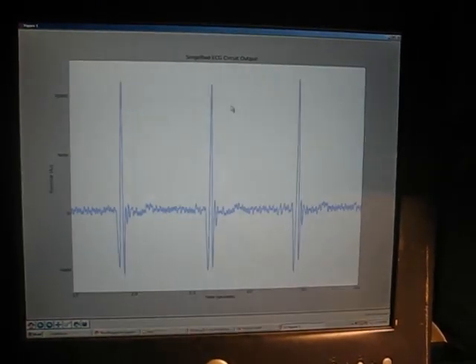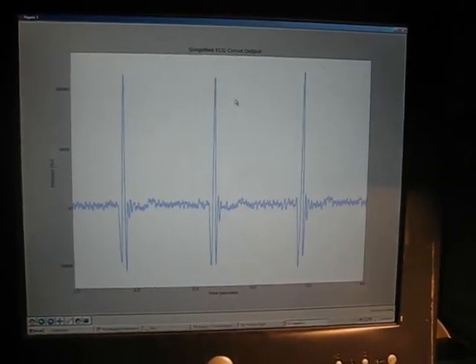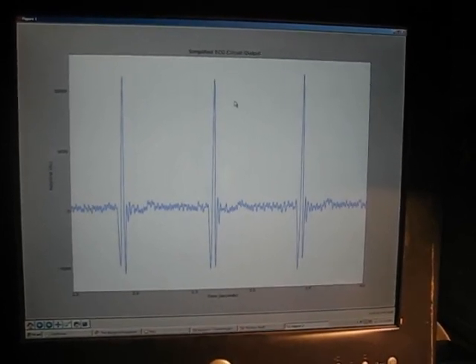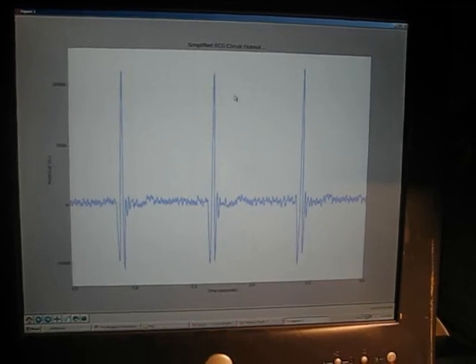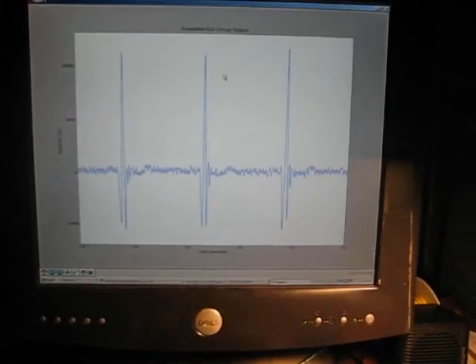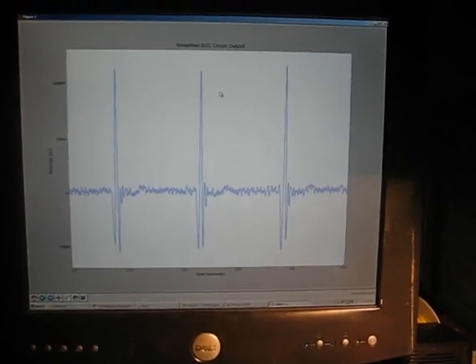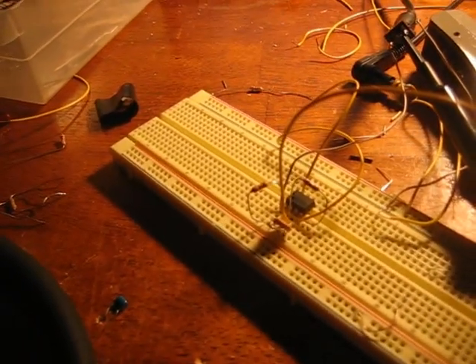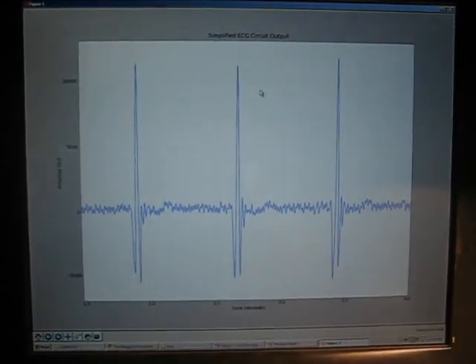Now keep in mind that you could eliminate a lot of the noise using fancy analog circuitry and several more operational amplifiers or even a more fancy instrumentation amplifier. But since we can do a lot of the signal processing with the computer software, we have the ability to greatly simplify our circuit. So this circuit is most likely what I'm going to end up using for my simplified ECG machine, and it produces pretty nice results.